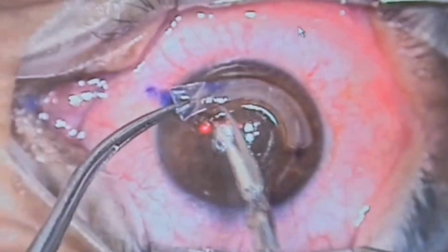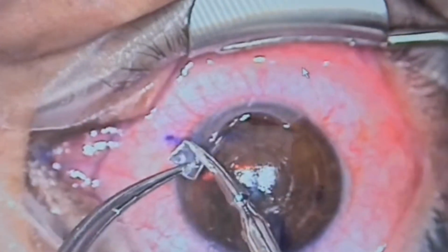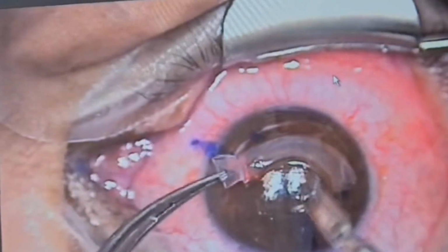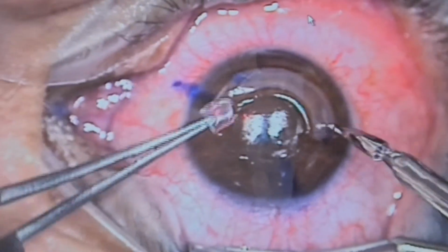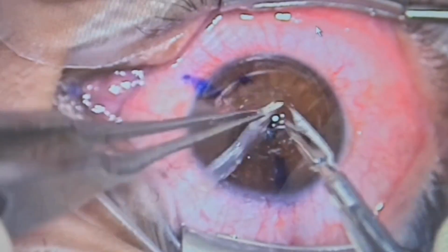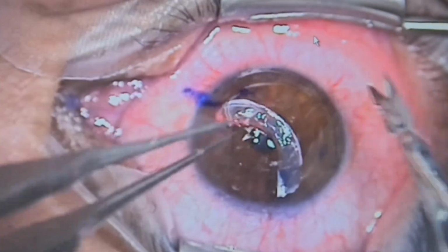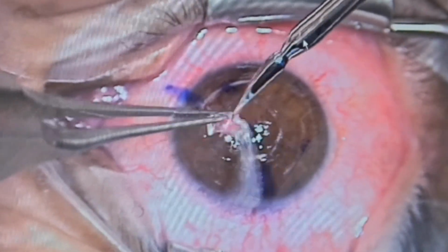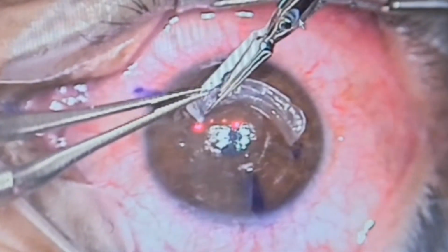Then I shorten. So I first start by shortening the segment, and after doing so, I will go to the superior temporal part, which is less steep than the inferior nasal part, and I will try to cut part of that tail to half its thickness. So hopefully, post-operatively, the corneal surface will rebalance according to what I have customized. Here I'm also almost done thinning out that superior temporal part.